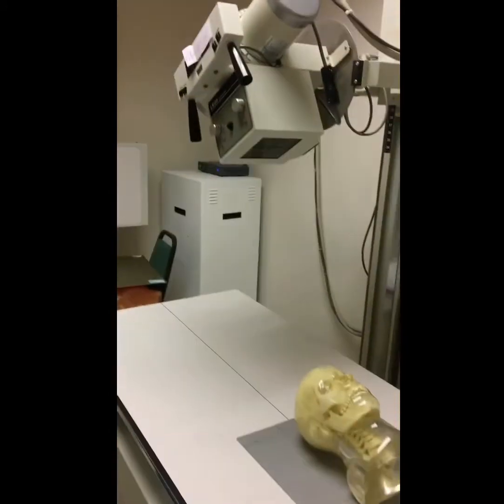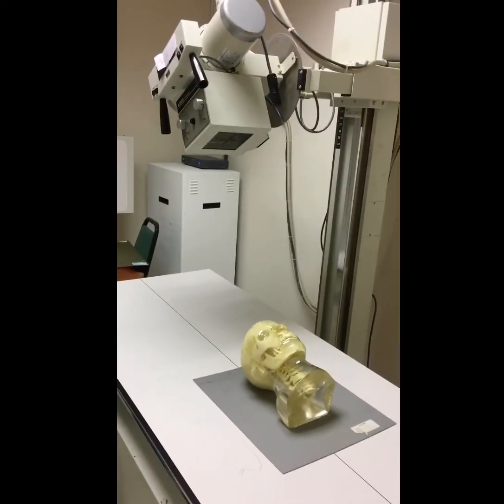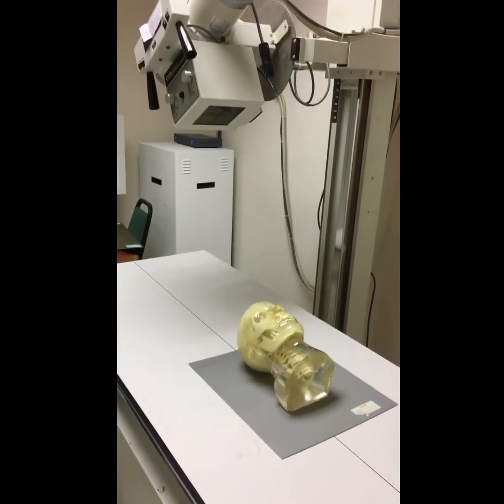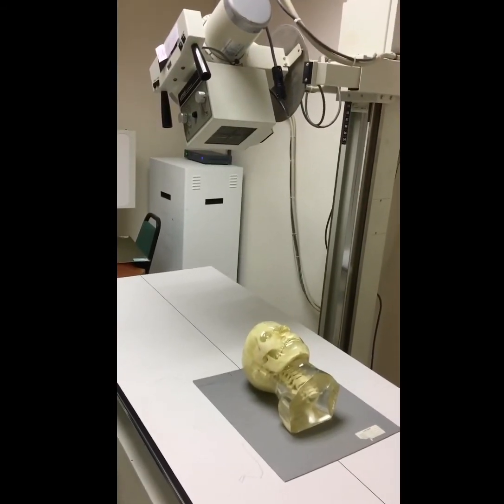Okay, so now we're going to be going over the off-level grid error. Off-level is very simple. It's basically when the angle of the X-ray tube is set up incorrectly, and what that could cause is elongation in the image and also lack of exposure.